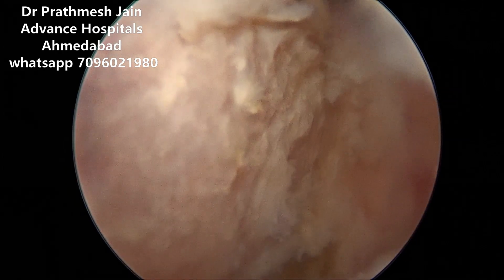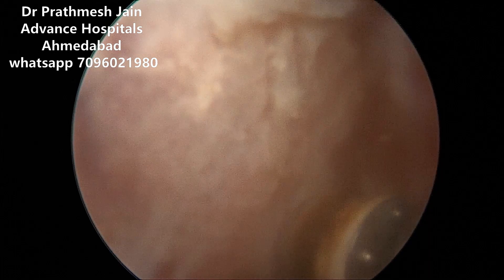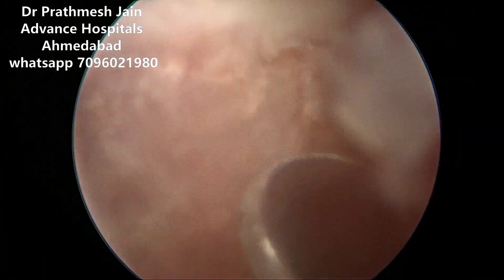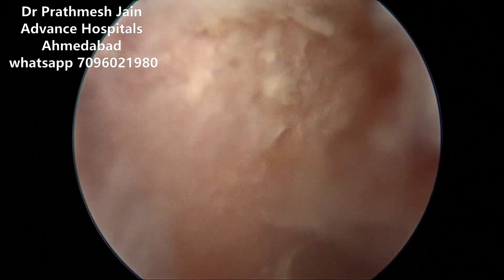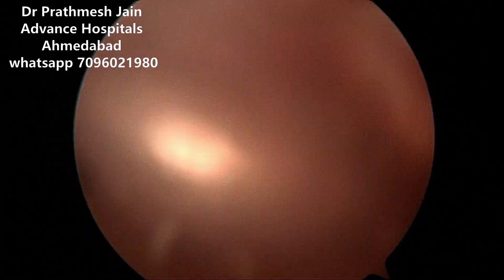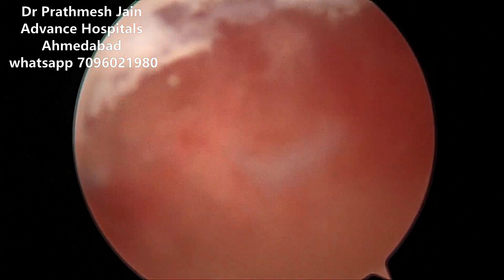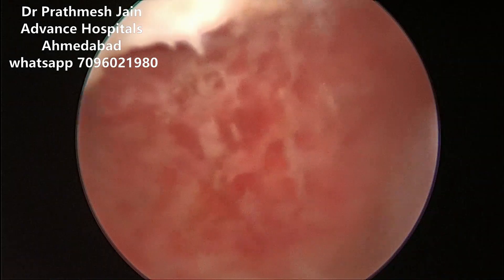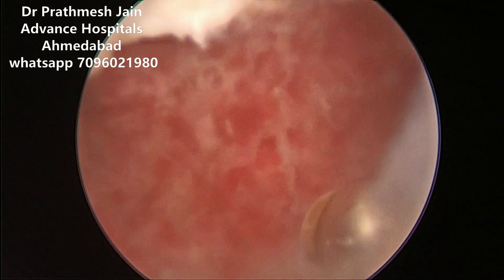The CAM resection is performed in this region. You can make a little bit of flexion in the hip joint for doing the CAM resection and use your burr to do the resection. Be very mindful because this resection needs to be perfect. Half cannulas are very useful at this stage as you need to switch instruments one by one. These CAM lesions can be divided sequentially with the shaver and the radio frequency devices. You need to be very precise — do not resect too much or too little; resect the exact amount of the CAM lesion.